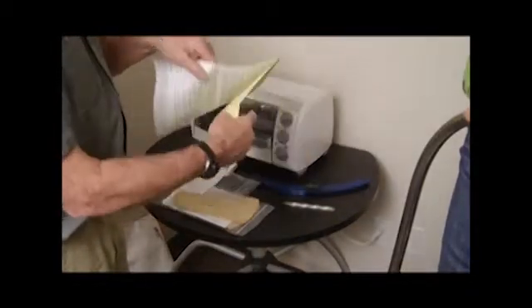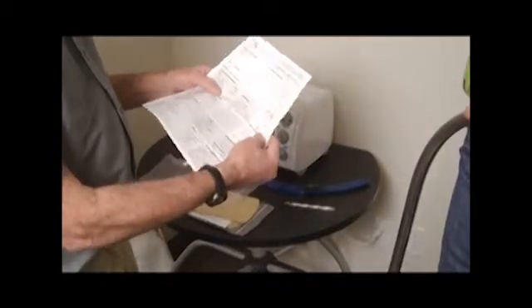The order form is 2 parts. It's an NCR form. The yellow portion is for you. The white portion goes to the lab. It's important to add the facility name and address, the contact name, which presumably is you, the patient information. So we have a patient name, height, weight, age, gender. Shoe size is extremely important because we need to trim the orthotic to their shoe size. The diagnosis or any other information that you think is pertinent for us to know in fabrication.